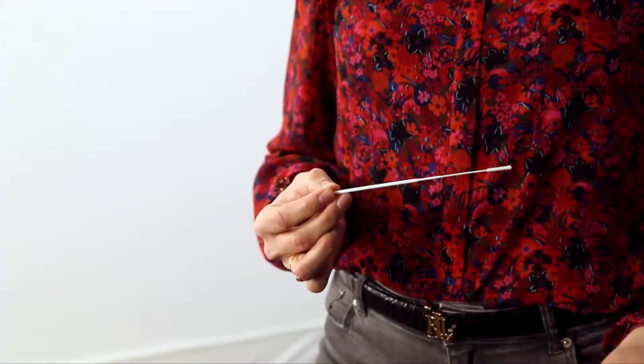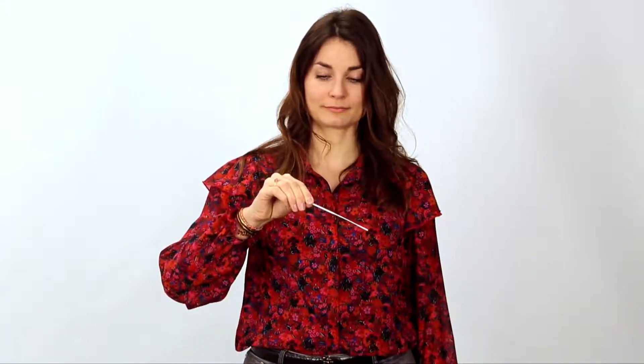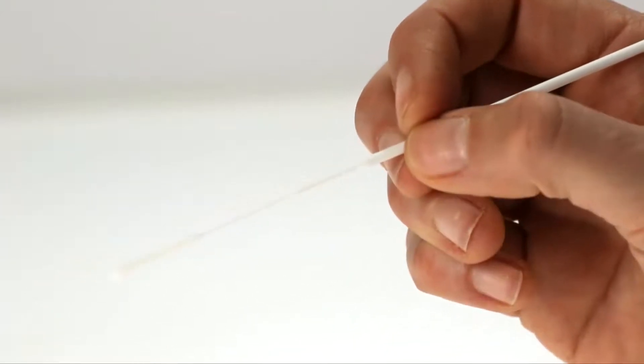Do not touch the tip of the swab. Hold the swab like a pen, between your thumb, index and middle fingers. This means that you are flexible if the swab meets resistance, and it helps you to avoid injury.